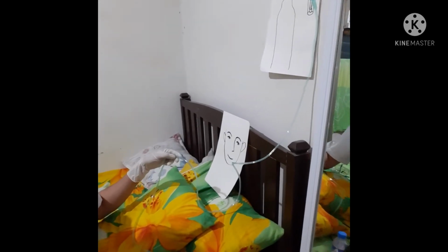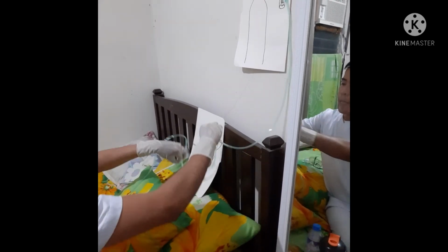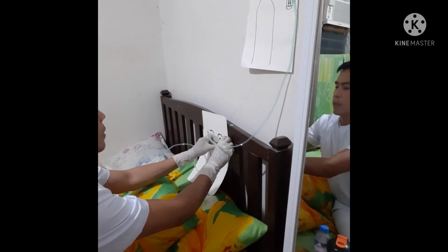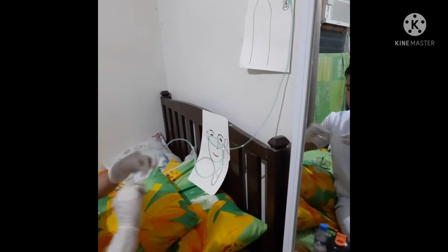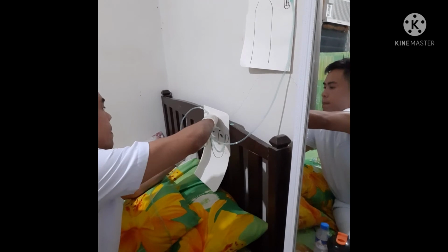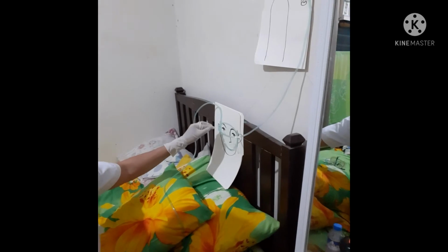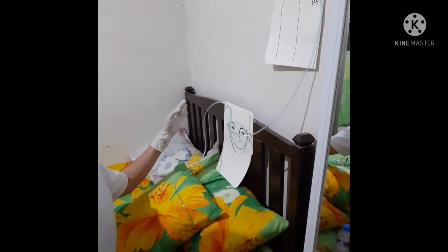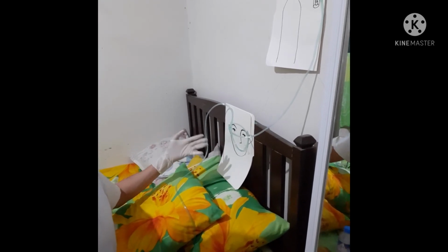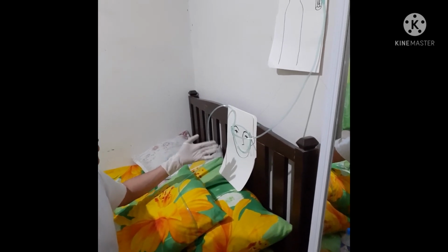Okay, and basically to help put the cannula in place, you can also apply a plaster onto the patient's face, just like this one. This is optional, but you can also do that. And sometimes the end of the cannula can be placed behind the patient's scalp, or it can be under the patient's chin. You need to adjust it whichever is more comfortable or more secure for the patient.